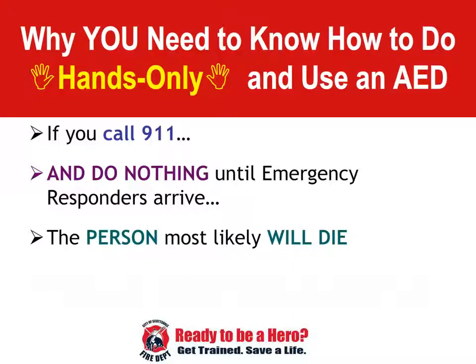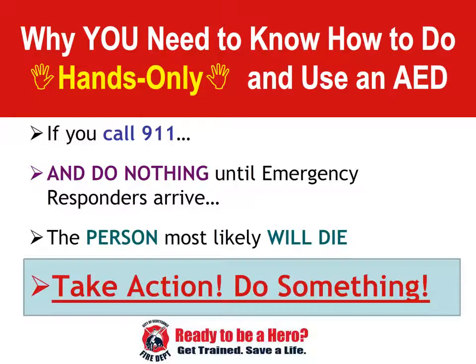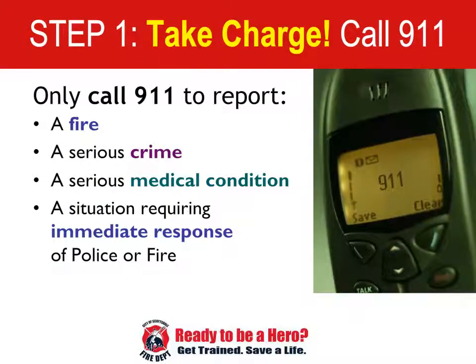Not great. You add CPR, it goes up to 80% chance of survival, and even more when you use an AED with compressions. Clearly, we can't save everyone, but giving that person a chance to go home to their families versus the alternative is a pretty terrific superpower. Now, how do we do this?